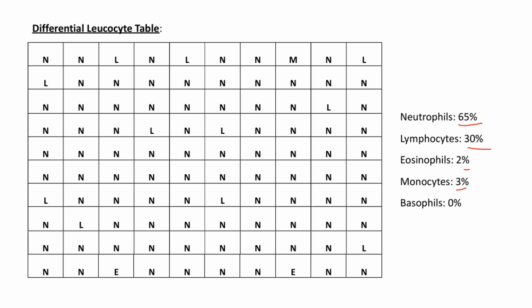in the record. So everyone, 100 people in the batch, they all wrote the same differential count and they would write the same thing in the exam as well. So obviously, right, we don't have the same thing for all the different samples, but the idea is you write something related to that. You write some normal values if you get RBC pathology, because here WBC parameters are normal in these RBC pathology cases.